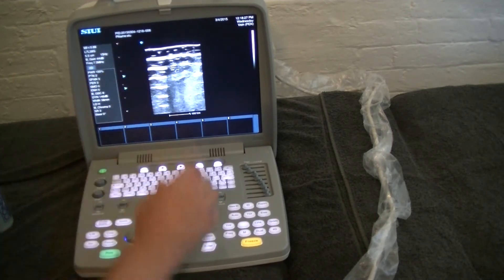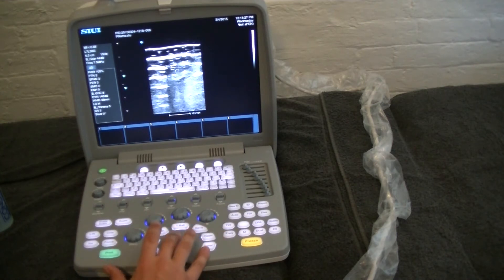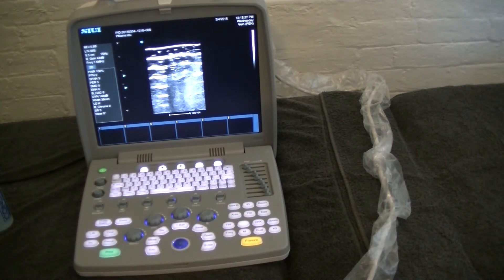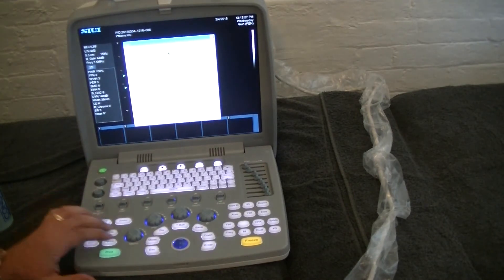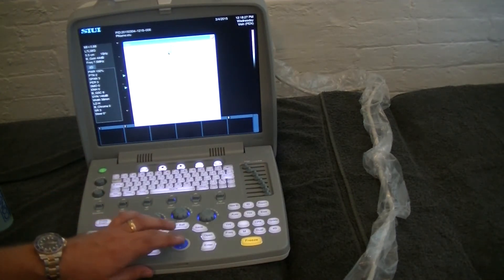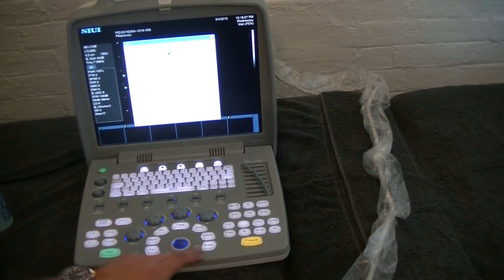The patient ID or name will come up at the top of the screen along with the date and time of the examination — this is really useful for record keeping. Next, I'm going to hit probe, which gives me an option to choose a preset. I can go through the different available imaging presets; let's try orthopedics.